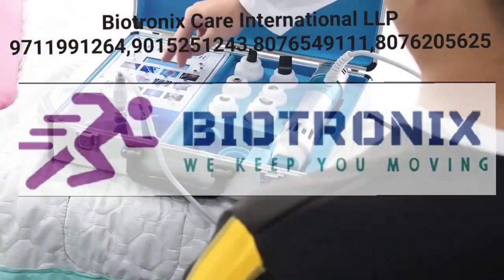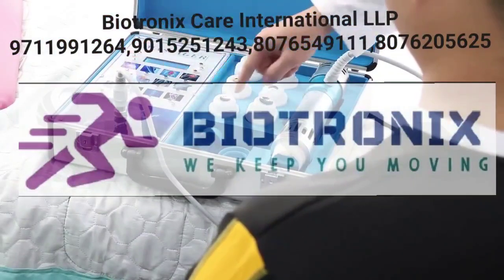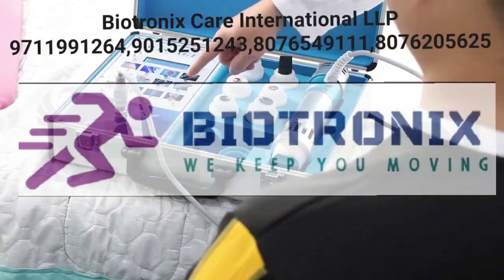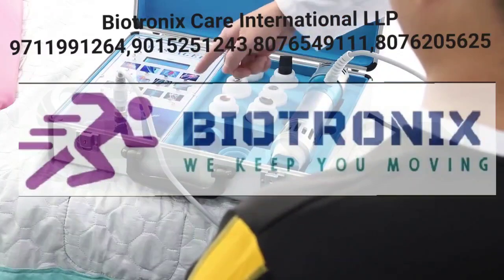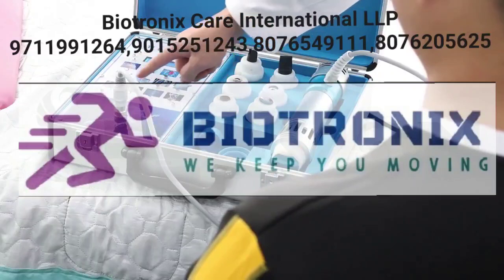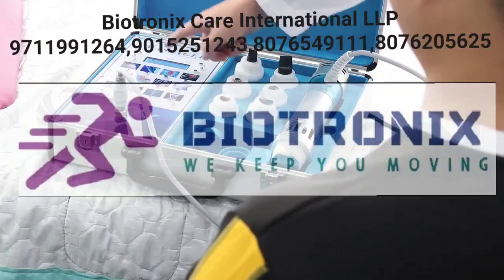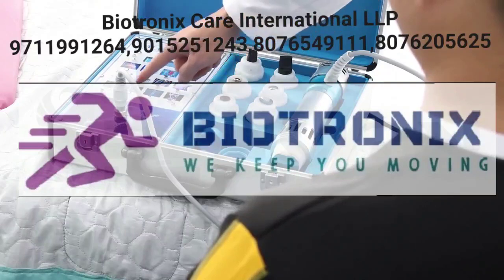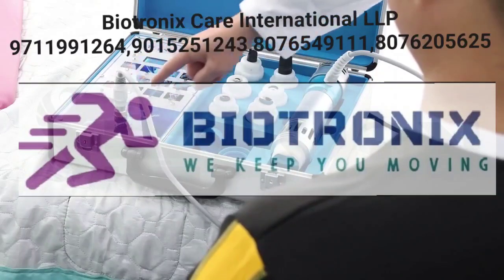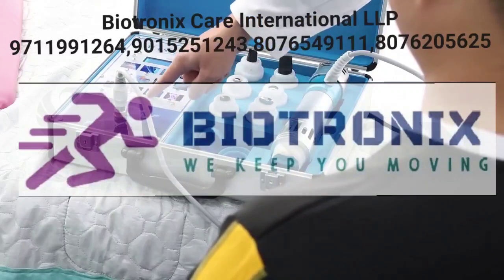So you will see the display over here. For each area of your body, you just select the button. For the shoulder, for the leg, you will see the light turn on for each area. For each area of the body, it will display over here that the data is already fixed. This is for the face. This is for the neck.